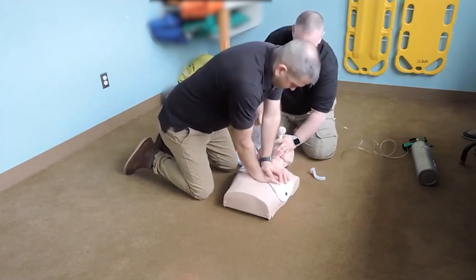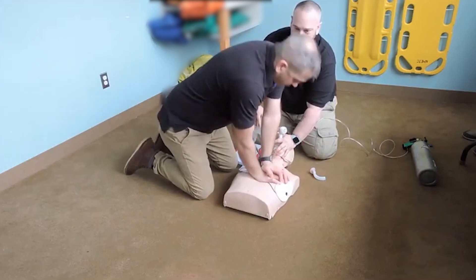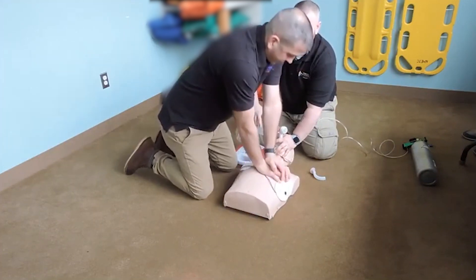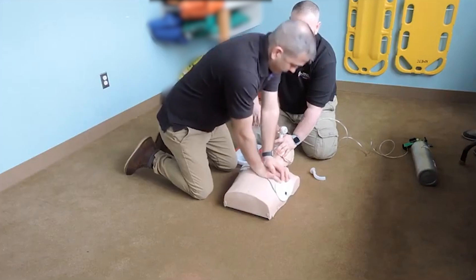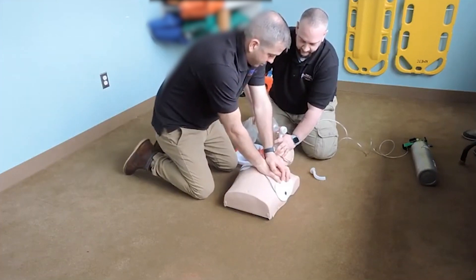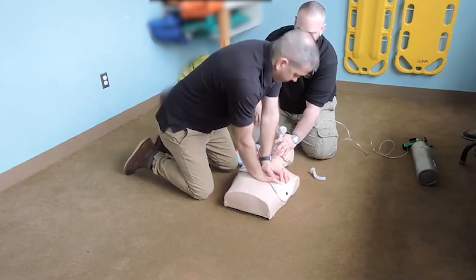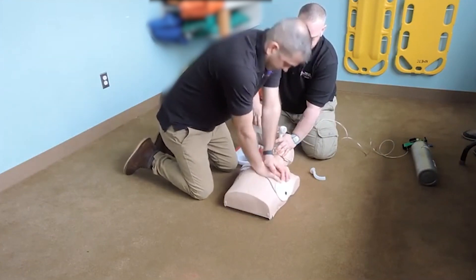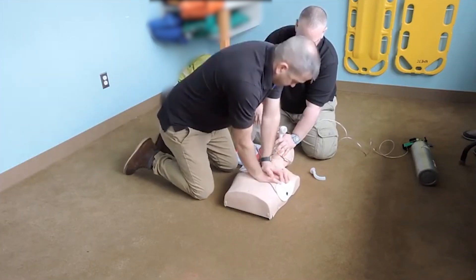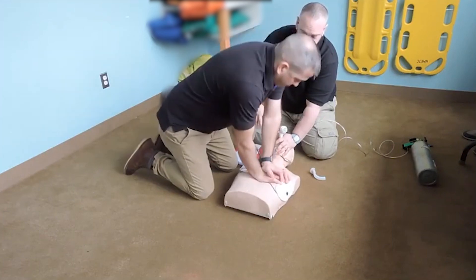Mask seal, head-tilt chin-lift. We're in good position. Let me know when you get close to 30 compressions. Delivering two ventilations, making sure we have good chest rise. We're going to go to a ratio of 30 to 2, aiming for at least 100 to 120 compressions per minute, pausing every 30 compressions for two breaths.